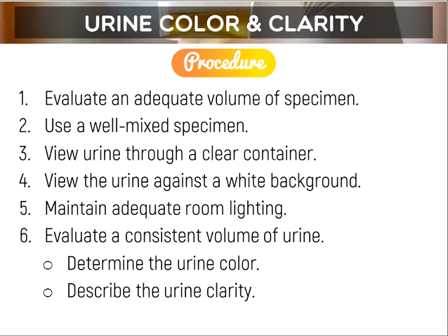As I discussed in clarity, take note of the description: prints can be seen, or prints blurred. I usually place any printed material behind the specimen so that you can see the floating particles in the urine.